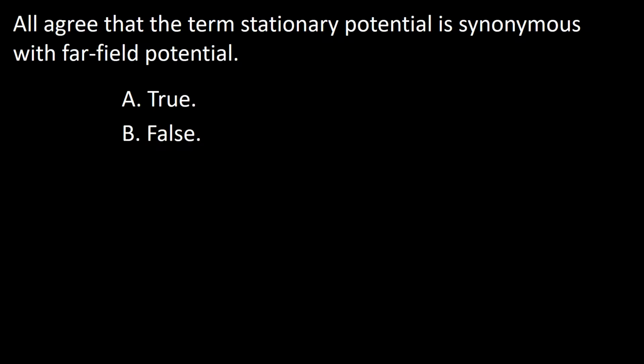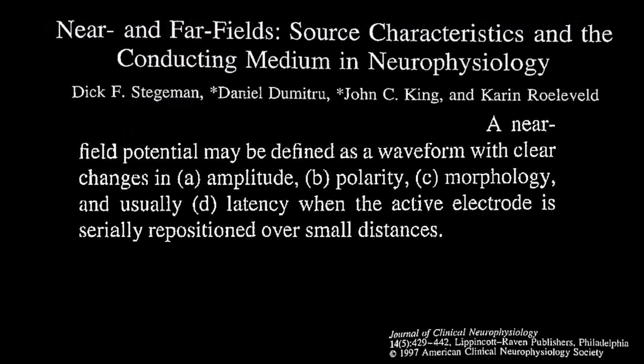Next question. All agree that the term stationary potential is synonymous with far field potential. A true, B false. The article I like most often to read about fields and evoked potential is the one that you can see in this frame. It was written in 1997.